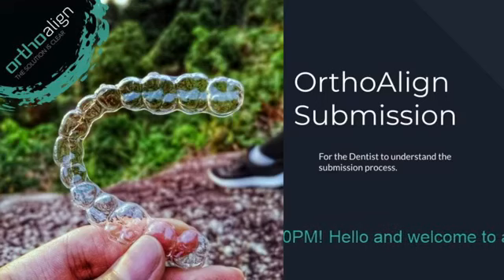Make sure it's clear and not blurry, especially for the OPG. You want to avoid the common errors. Common errors are that the patient is not in the center, is too far forward or too far back, or is looking up or down. You want to make sure that the patient is in the correct position for the OPG. We also want to avoid too much overexposure or blocking in the OPG.